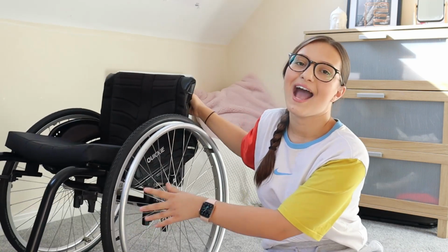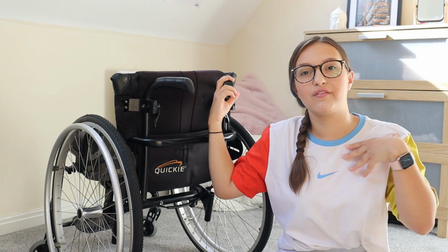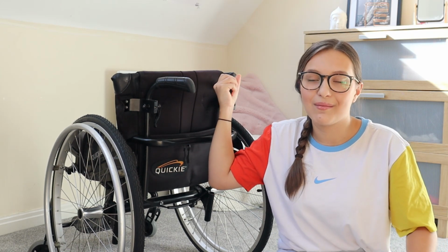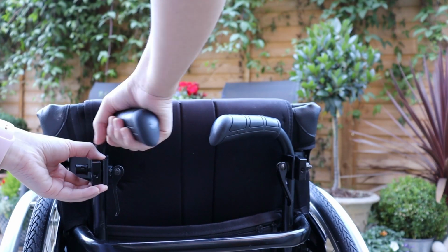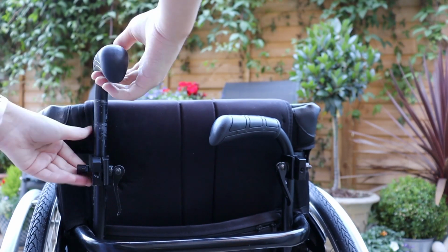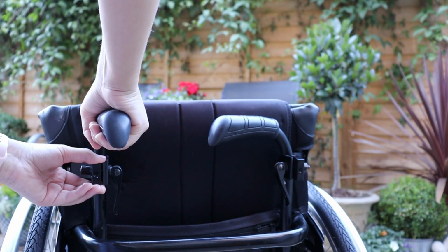And then a feature that I have to have on a wheelchair are handles, because I'm not able to push myself very far as I do have problems with my upper limbs and they are quite weak, so my friends and family do have to push me in my wheelchair a lot of the time. But handily enough, my dad put these wheelchair handles on them which are able to fold down and up, so when I'm using them they can be out, and then if I don't want to use them and I want to push myself for a bit, I can put them down.